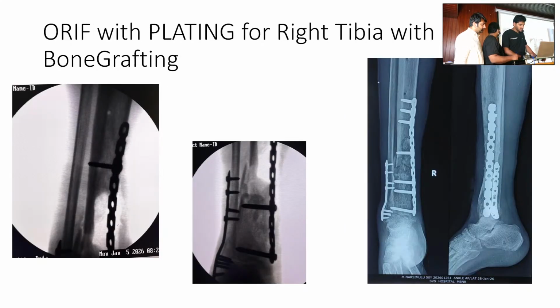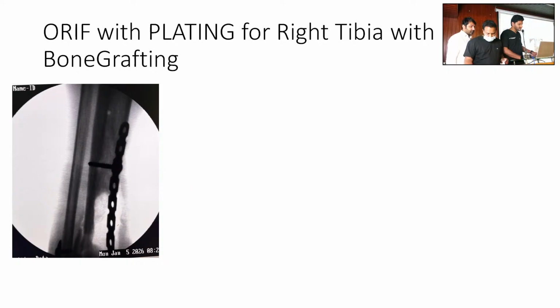We've done open reduction internal fixation with a 4.5 mm locking recon plate, sir, for the right tibia, and we also put a tricortical graft from the iliac crest and put a screw through it, sir, for additional stability. So there are 3 procedures done now. Yes, sir. Will it unite? Optimistic. Yes, it will unite, sir, because of the tricortical graft. Go to the first slide, sir.